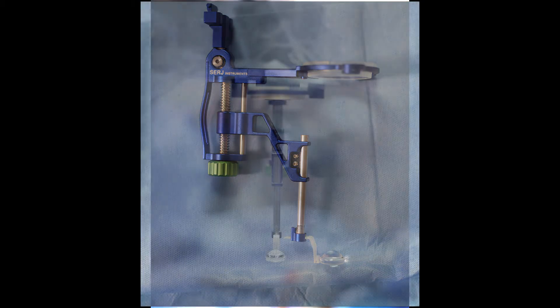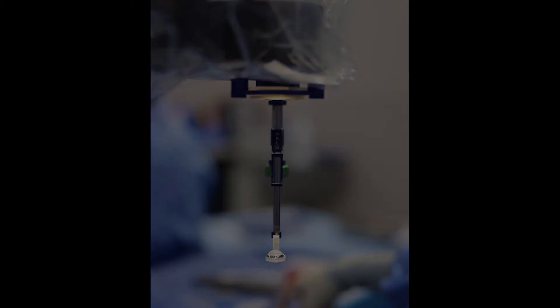The thing that makes the HALO so versatile is the fact that you can use reusable lenses. I'm personally not a fan of any reusable lenses — in my mind, to get the most out of the beautiful view we get from Ingenuity, you really need disposable lenses because over time the reusable ones can deteriorate. But when I look at the disposable lenses, specifically the HD lenses from Oculus, they fit on perfectly and work flawlessly with this setup. The ability to utilize existing lenses on the HALO makes it incredibly valuable. You're not locked in to using just the platform that works with the HALO.